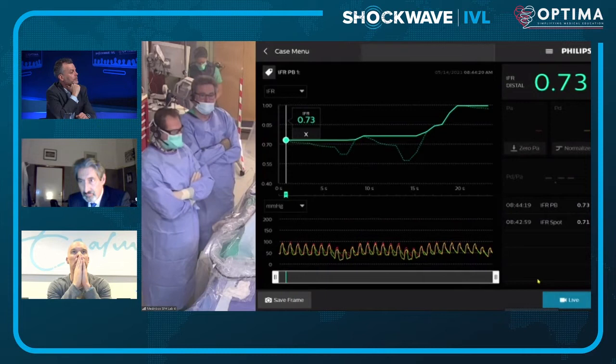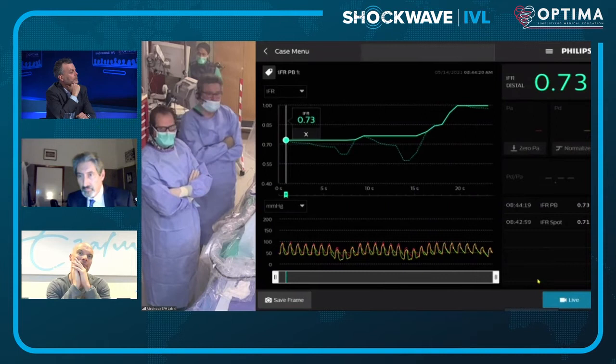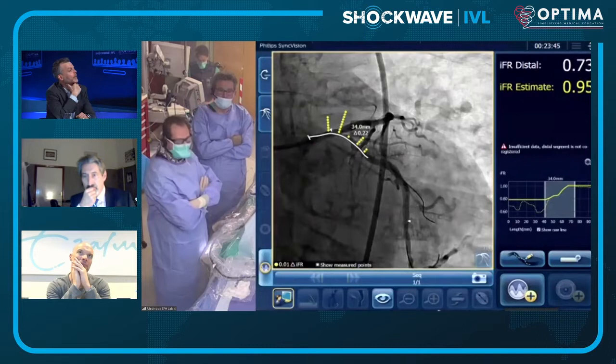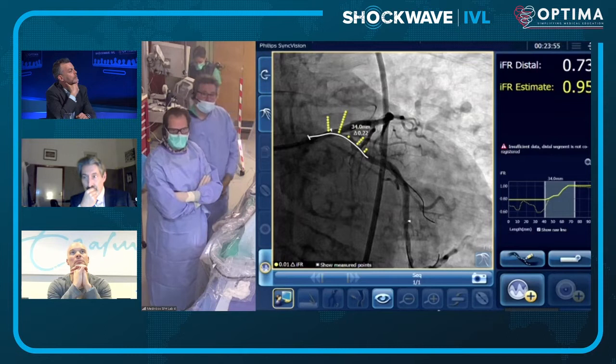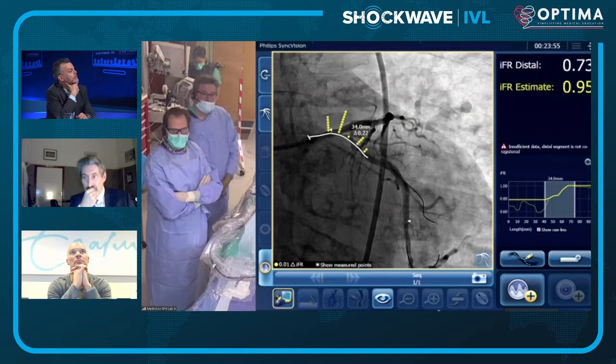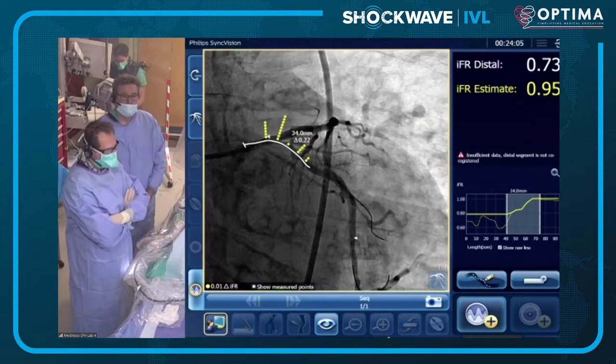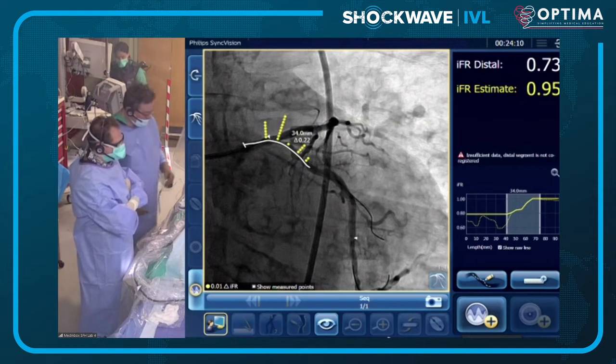Alan elaborates: with SyncVision co-registration, the angiogram can be overlaid with the iFR pullback — showing the majority of the gradient is at the osteal circumflex and possibly a little in the left main. This also allows measurement of stent length: approximately 33-34 millimeters based on SyncVision to cover the entire lesion. James: That's really helpful information for procedural planning — if you don't start with a clear goal you won't get to the right position.